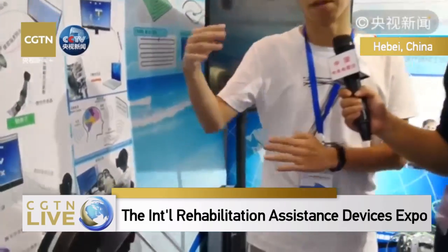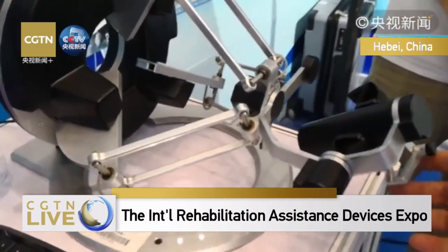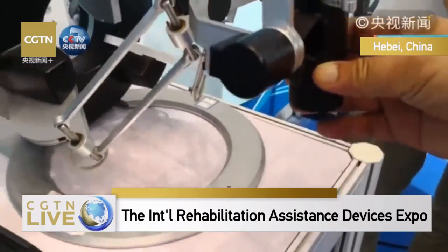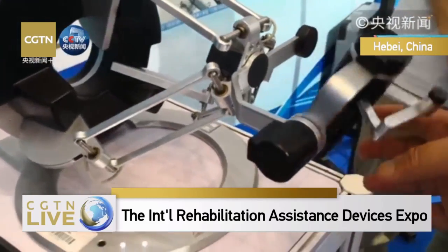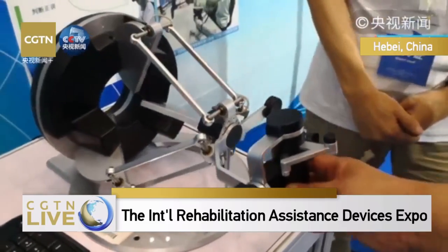We have done a lot of experiments on many cohorts and already have a benchmark standard. And when we have a new customer, we can compare his or her statistics with the benchmark and give rehabilitation suggestions. It is also an evaluation for the recovery situation of the patient.